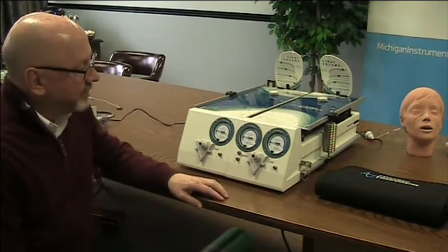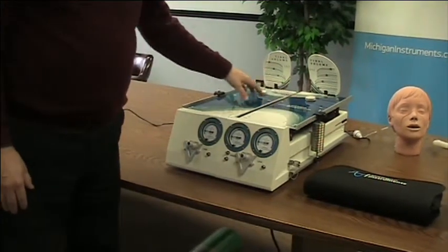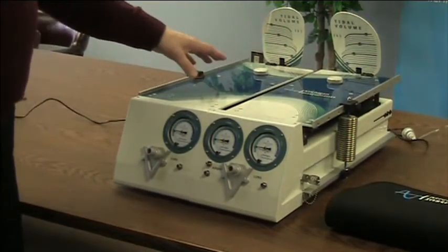Hi there. Today I want to do a quick in-service on the TTL training test lung from Michigan Instruments. We're going to be working with the dual adult TTL today, and with the dual adult we have two adult lungs and we can ventilate one or both of those lungs simultaneously.